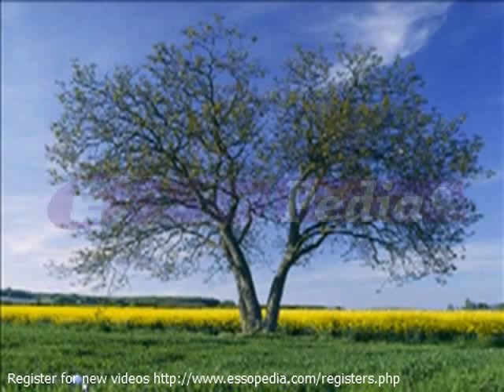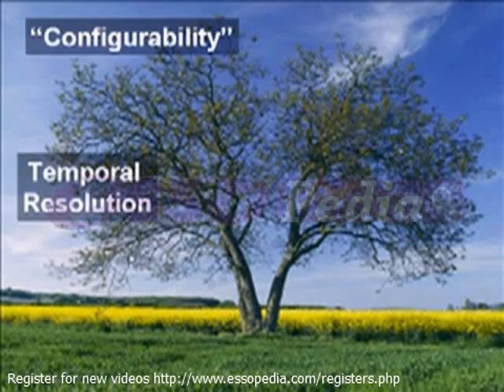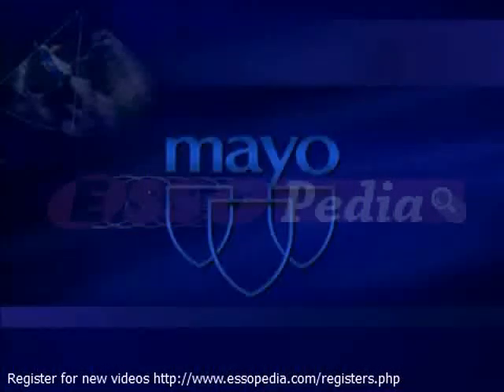So in general, again, echocardiography really stands alone in the field of non-invasive imaging based on its configurability and our ability to bring this imaging modality to the bedside, its unparalleled temporal resolution, the fact that it uses a harmless energy source, that it gives us unique insights not only into cardiac morphology, but as well into physiology. And again, when asked to evaluate for management or diastolic dysfunction, we're reminded again that it is these three key measures that we can use in daily practice to unlock many of the mysteries.